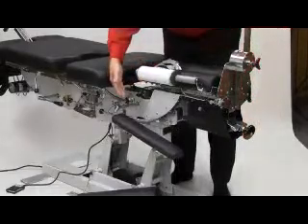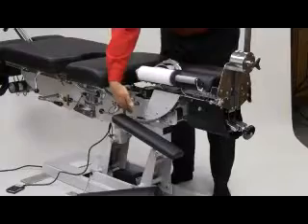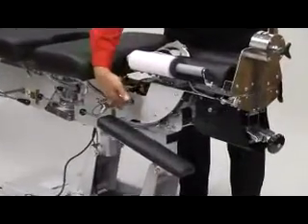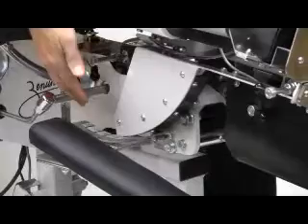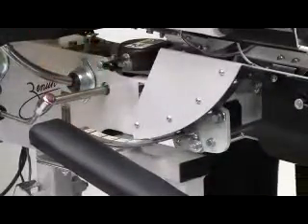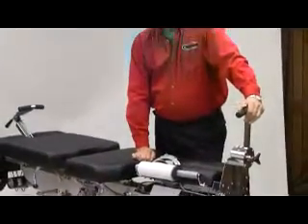As you can see on the side of the frame on both sides, we have indicator markings to denote where the range of motion improvement has occurred. So each stair step on the side provides markers for the doctor to detent and lock positions for the patient's comfort and treatment. That concludes the cervical flexion distraction section of the Zenith 100 table.